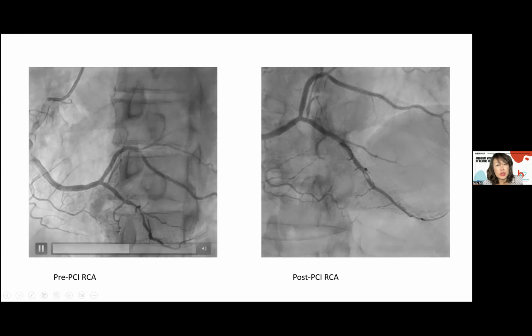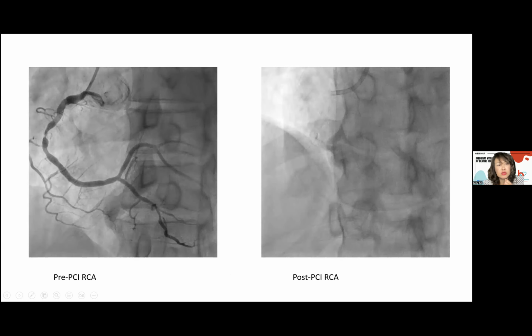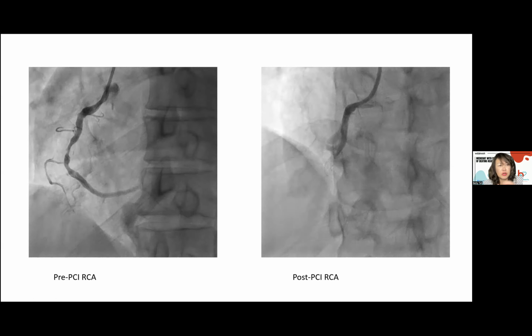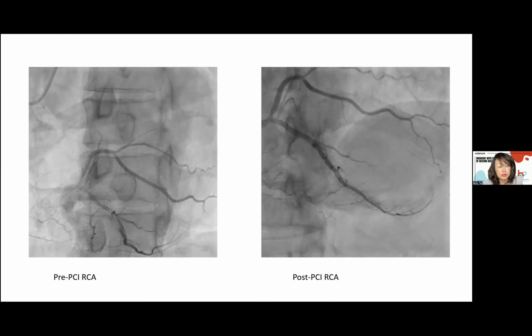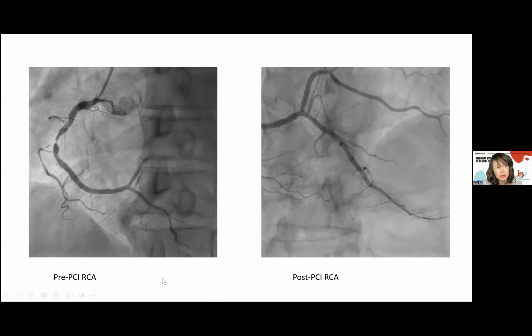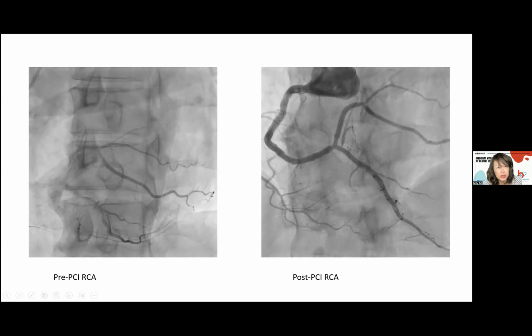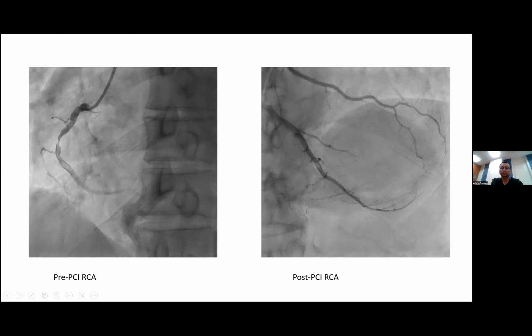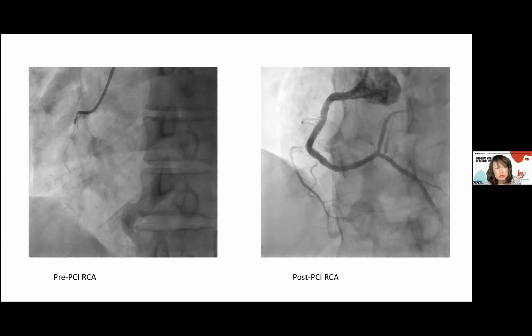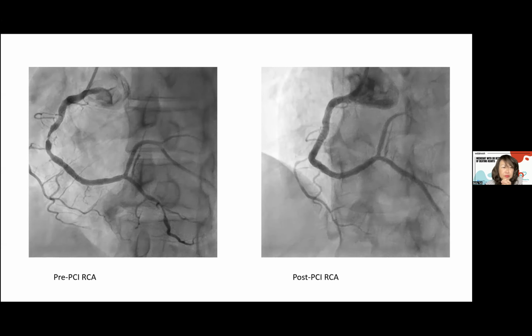Can I stop you here and ask you what is the risk factor for this gentleman? His vessel looks diffusely diseased, even though there are just areas of significant blockages that make it simple for us to treat. But his overall disease is quite bad, no? Yeah, it's quite bad. He actually has type 2 diabetes, and he is also a smoker. I see, no wonder. So that's the issue.